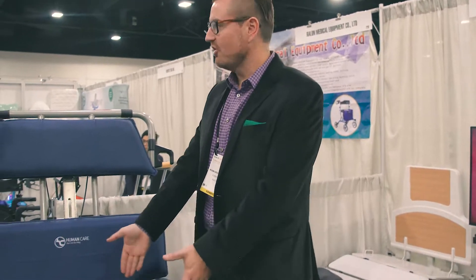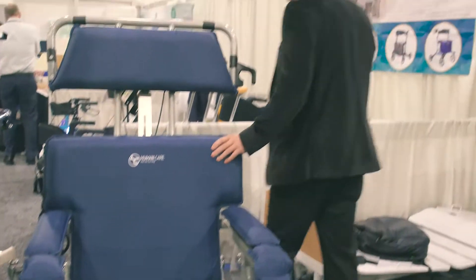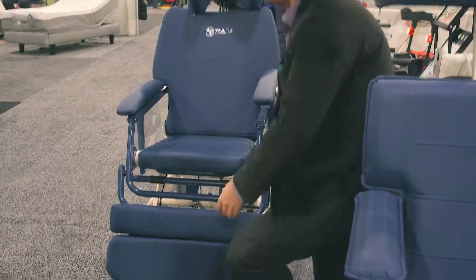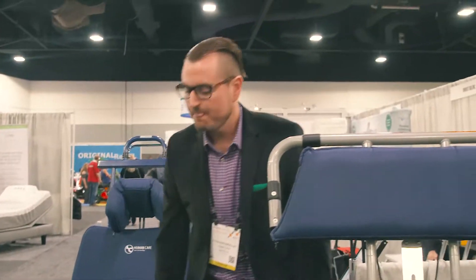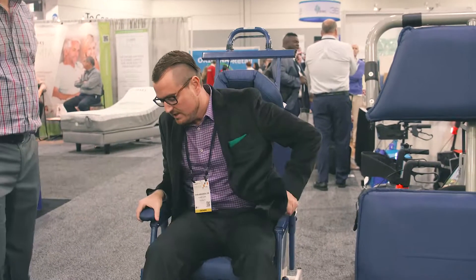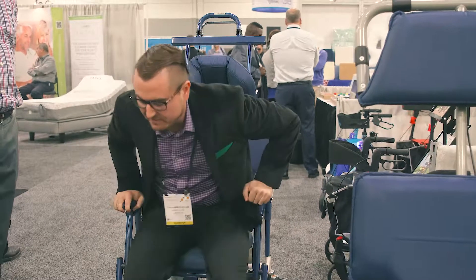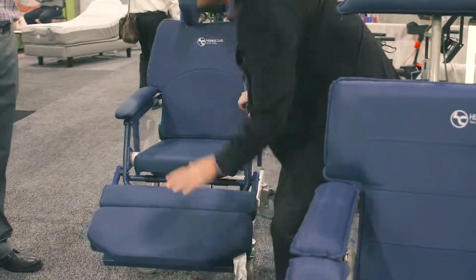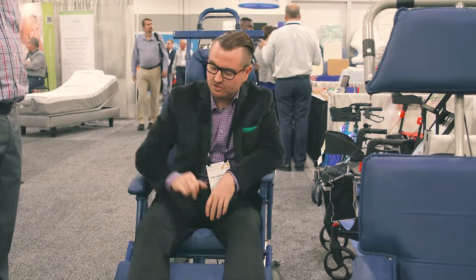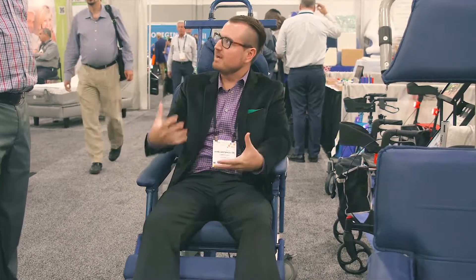Not all skin breakdown is on the sacral area — the second most common area is the heels. One of the key features on this chair is a calf pad. In a regular chair or wheelchair, circulation gets pinched at the back of the thigh. When you sit in this chair, your calf always hits the calf pad so your heels are able to float — nothing is touching them, so they're able to breathe and heal. Nurses typically try to use inflatable booties to float the heels, but with this chair you can adjust it so the heels float completely.